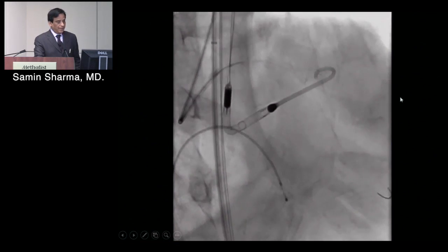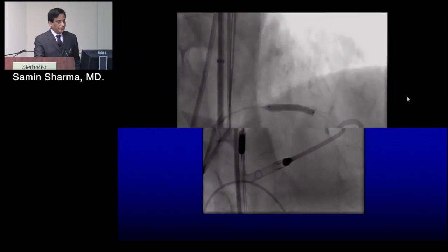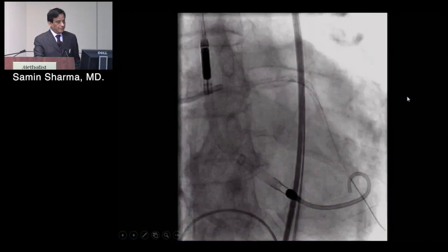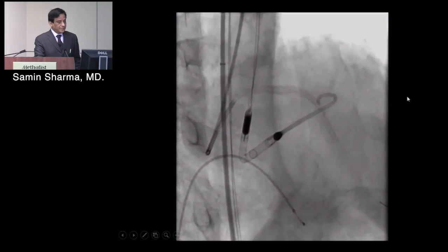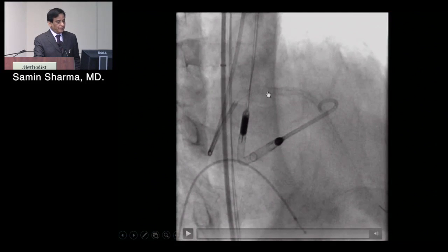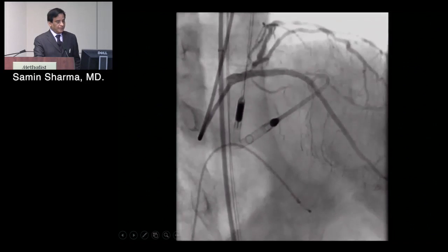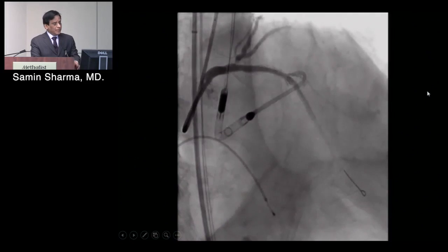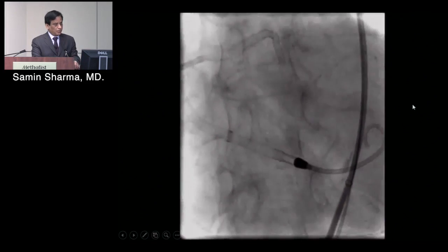Put an Impella in this particular case, and then after atherectomy, you start seeing the lumen dilatation and post-dilate with the high pressure. And even if you have done the moderate atherectomy, your full stent expansion will take place and side branches will be preserved. And this is one of the important points for the atherectomy, that you don't close the side branches. And so clearly on all these devices, as we know, you remove the support device at the end of the procedure.